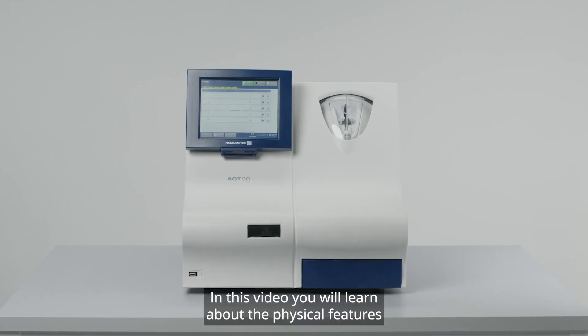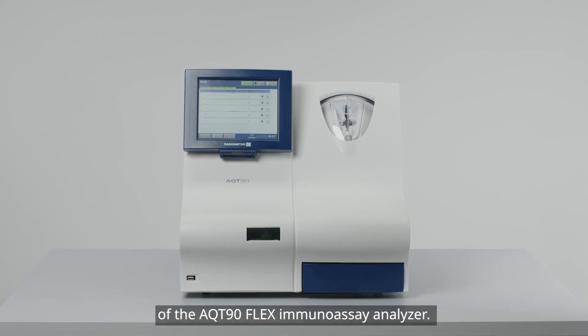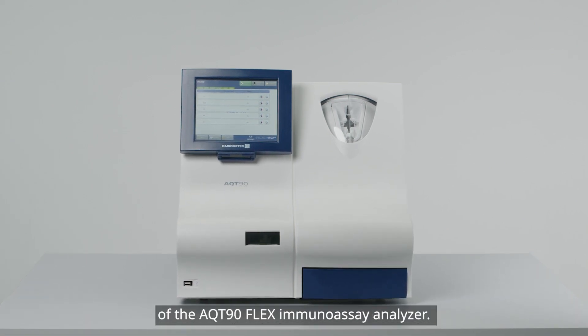In this video, you will learn about the physical features of the AQT90 FLEX Immunoassay Analyzer.